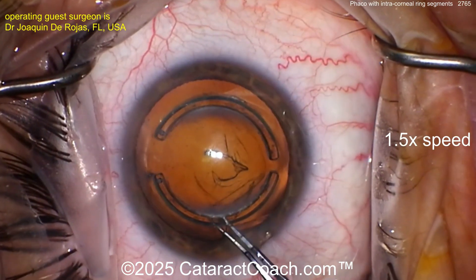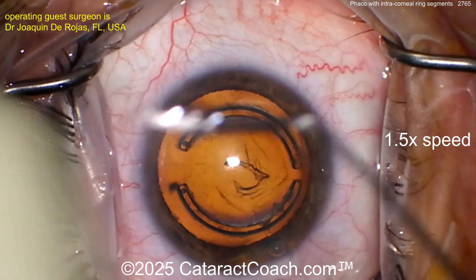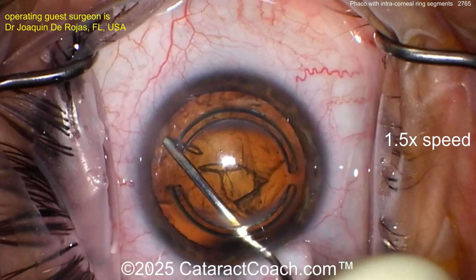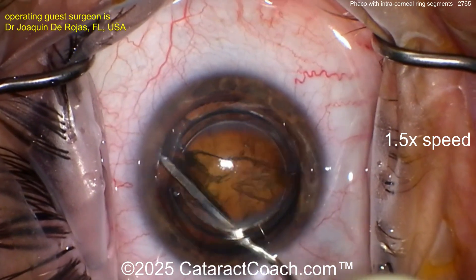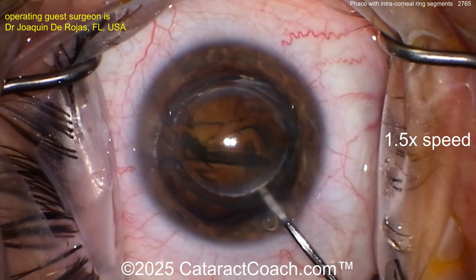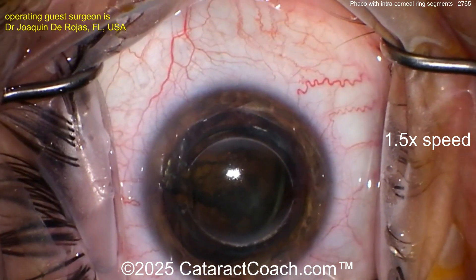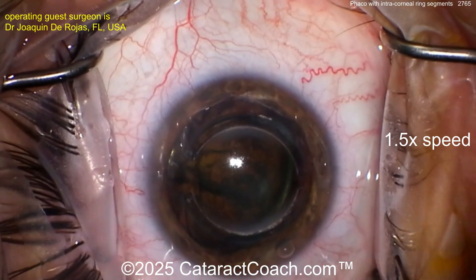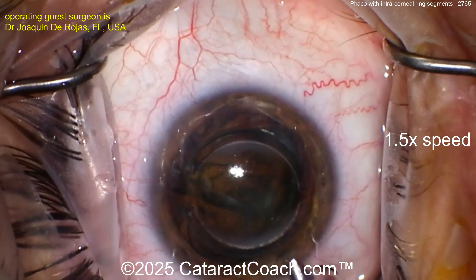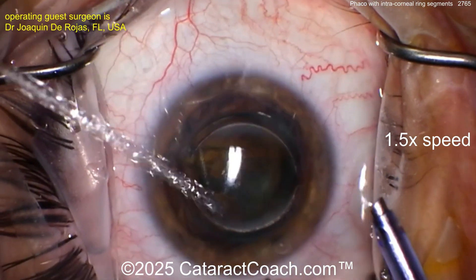This patient had intracorneal ring segments placed for treatment of low myopic myopia. Back in the day, decades ago, intracorneal ring segments — the Intacs device — were first put on the market for treatment of low degrees of myopia. By placing these corneal pockets, you achieve central corneal flattening. We've since seen intracorneal ring segments used primarily for keratoconus or corneal irregularities.